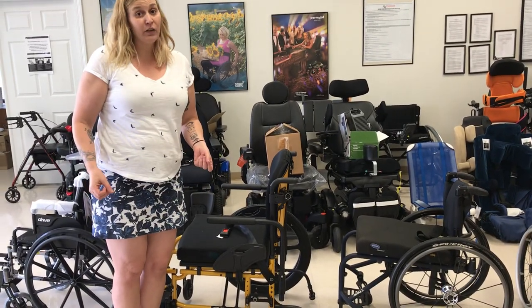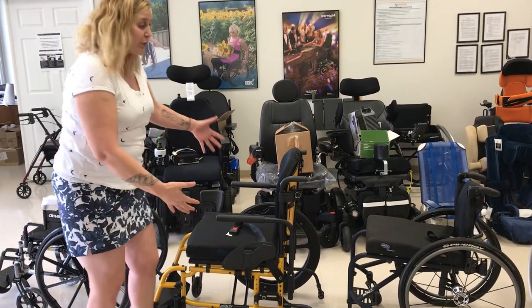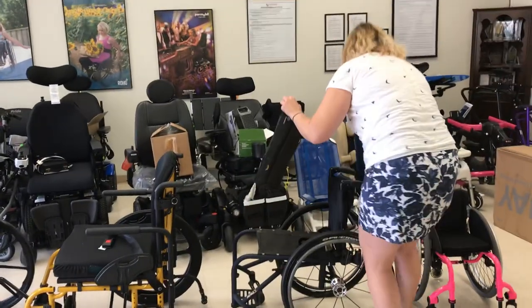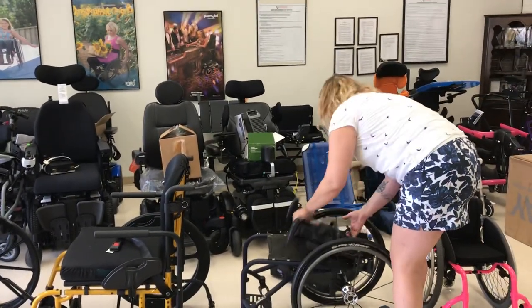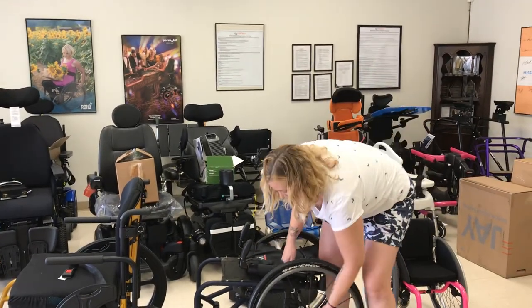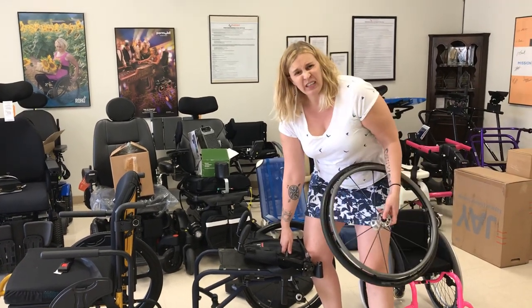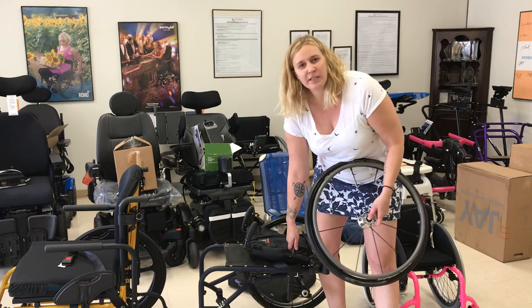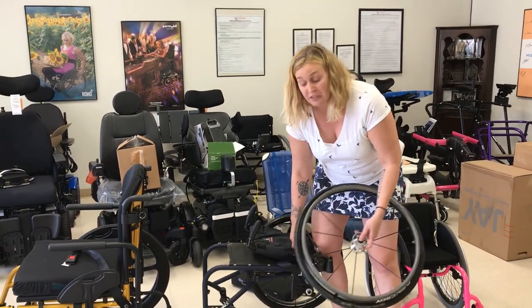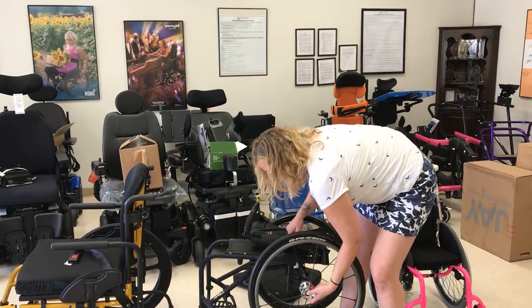There are a couple other things we can look at. These chairs can fold up differently — this one folds up the standard style, but we can also get one that's called a rigid chair. These fold down and you're left with an L-shape that can go in the car. So for people who are independent, this is really easy because they can pull it across themselves from the driver's seat into the back seat or the passenger seat, rather than having it be really tall when it's folded.